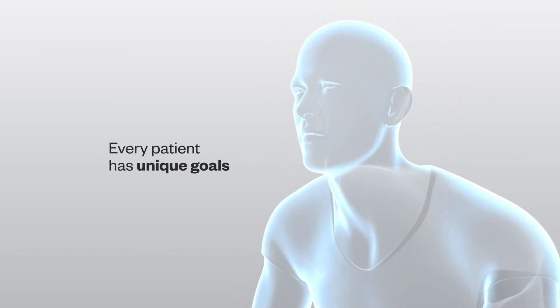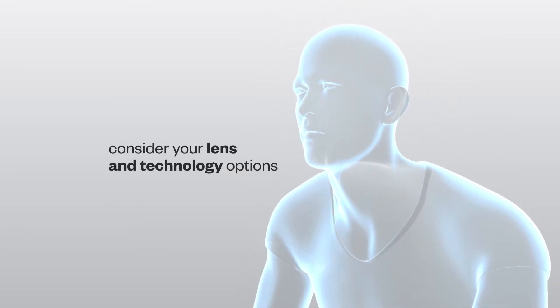In order to achieve your vision goals, you should carefully consider your lens and technology options.